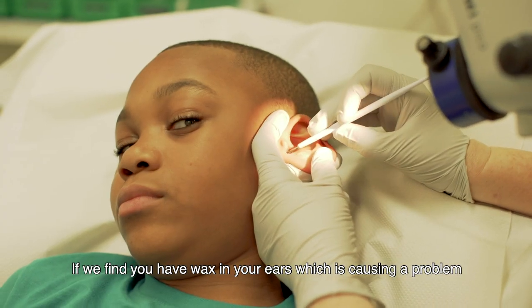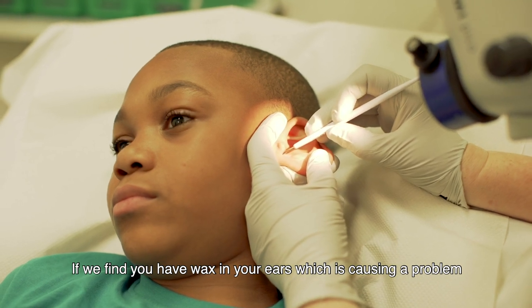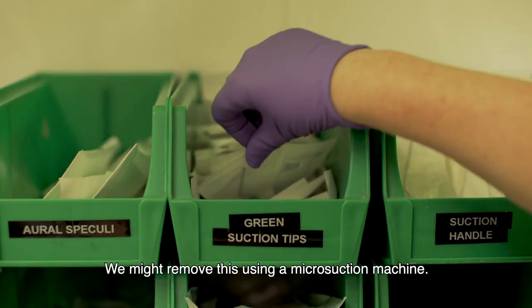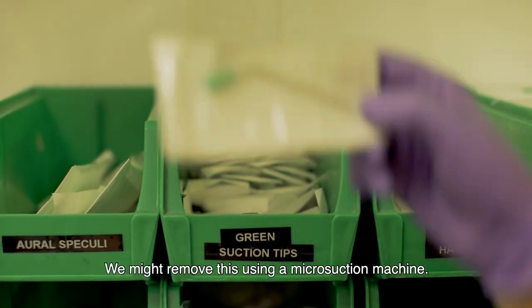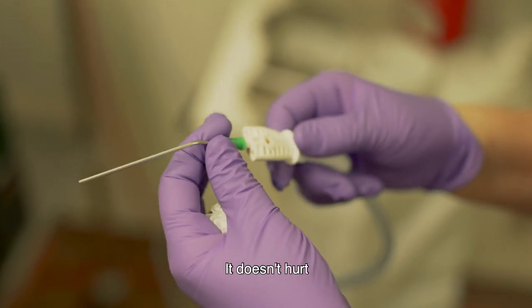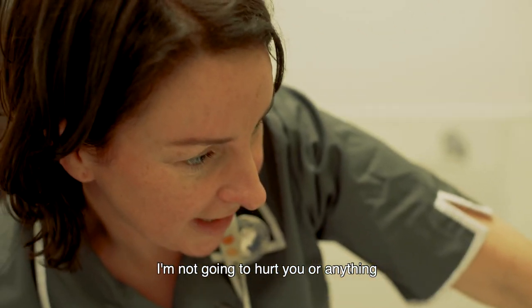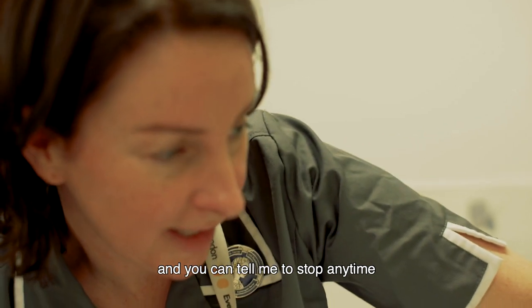If we find you have wax in your ears which is causing a problem, we will remove it. We might remove this using a micro suction machine. It doesn't hurt and it's just a noisy tickle in the ears. It'll be noisy, but I'm not going to hurt you or anything, and you can tell me to stop any time.